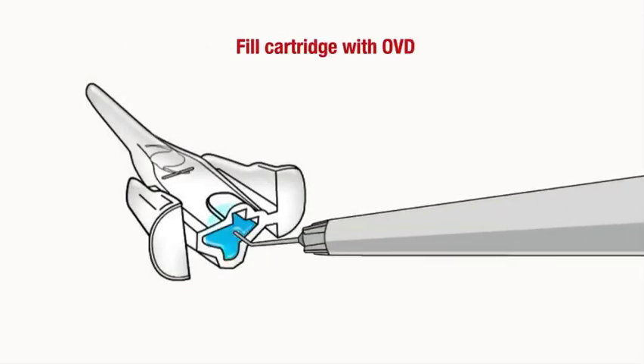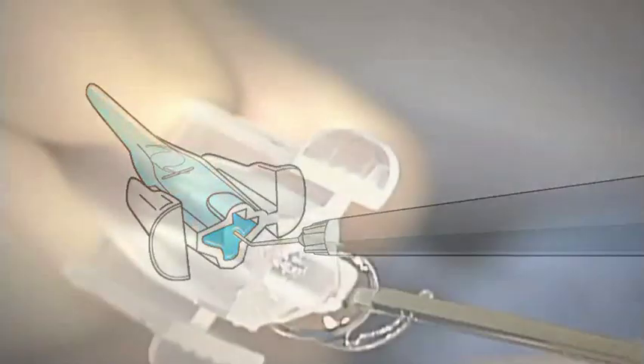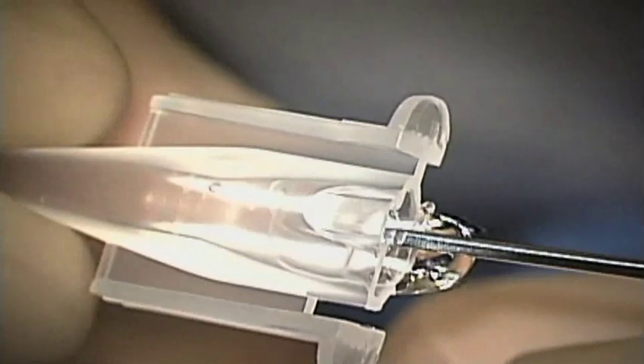Begin by removing the cartridge from the inner tray and generously filling with Helon Viscoelastic. The Viscoelastic should be at room temperature. Grasp the lens with forceps by the optic edge only and hold the cartridge with the IOL diagram facing up.